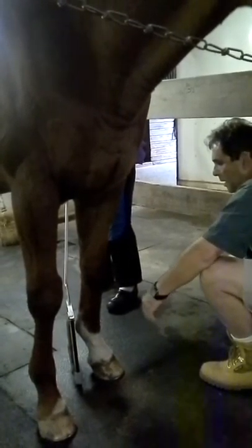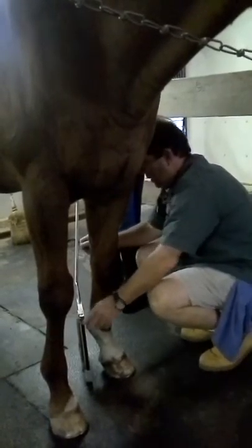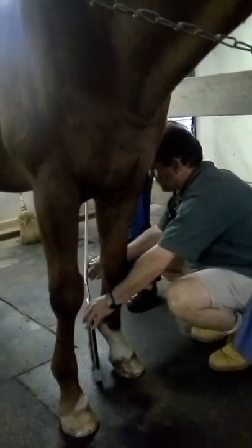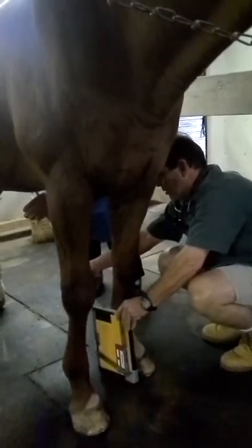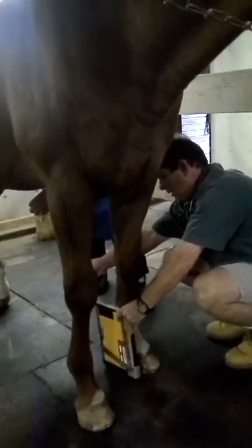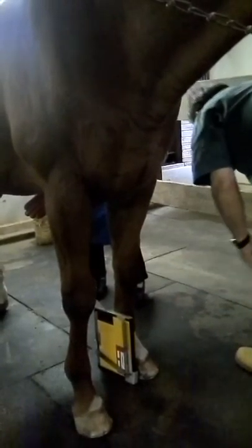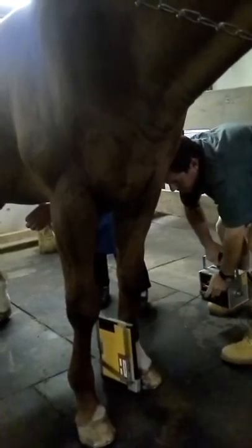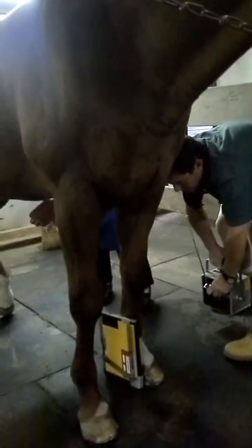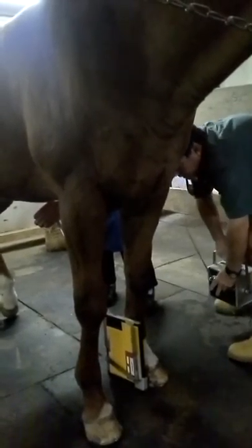The next view you would take is a straight lateral, which means putting the film either underneath the horse like this — a straight lateral view like that — so it's perfectly parallel to the position of the anchor. You do the same thing again: you point there, pick up your pointer, and fire at the appropriate time.